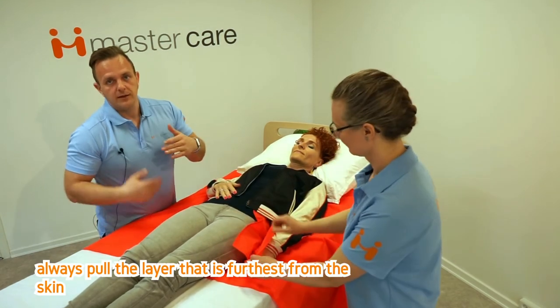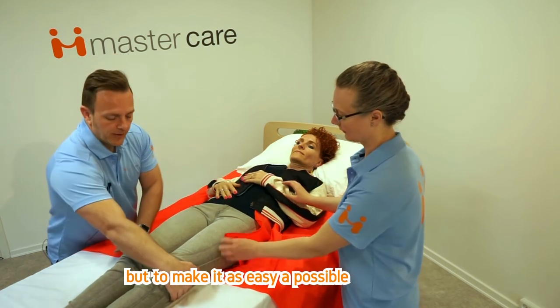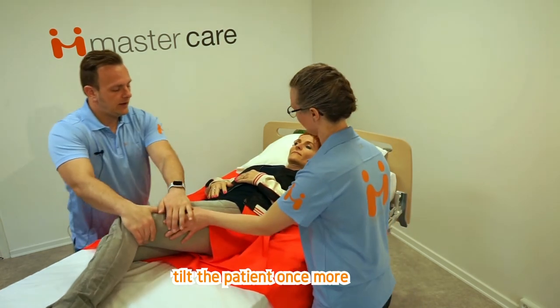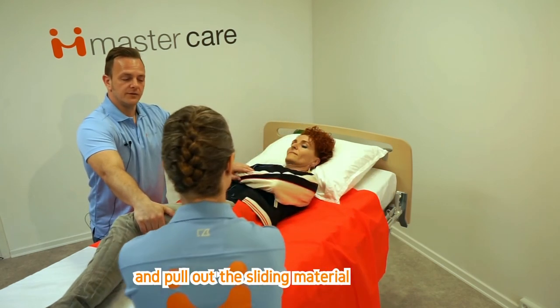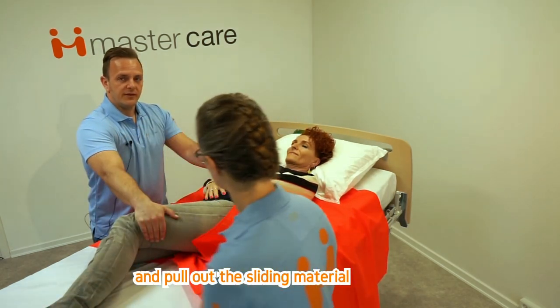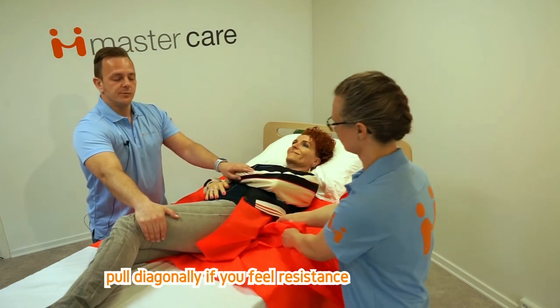Always pull the layer that is furthest from the skin. Pull it out from the side. Pull diagonally if you feel resistance.